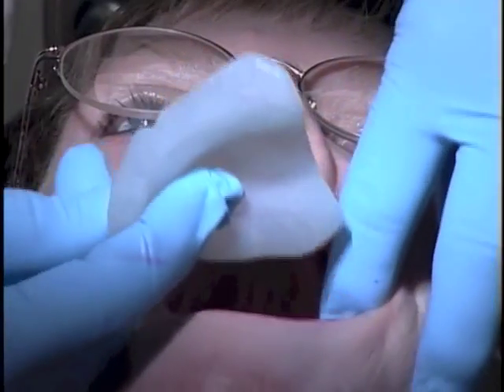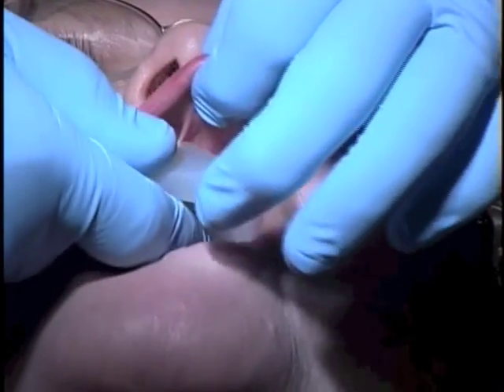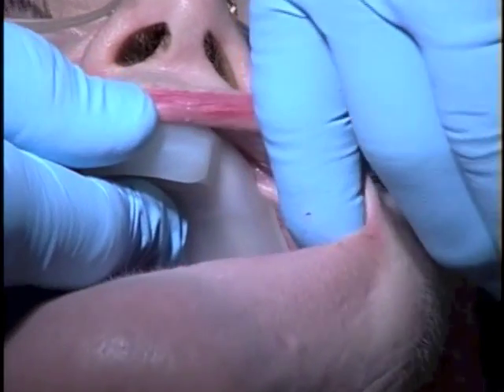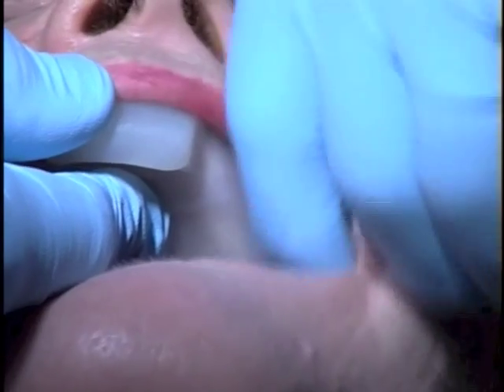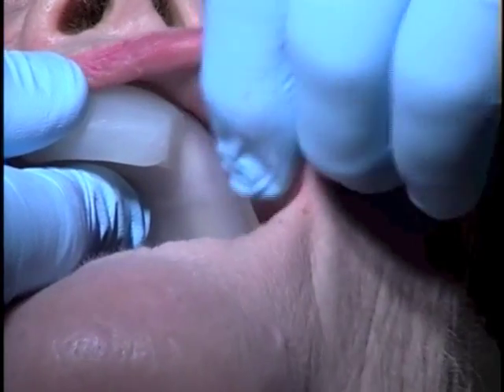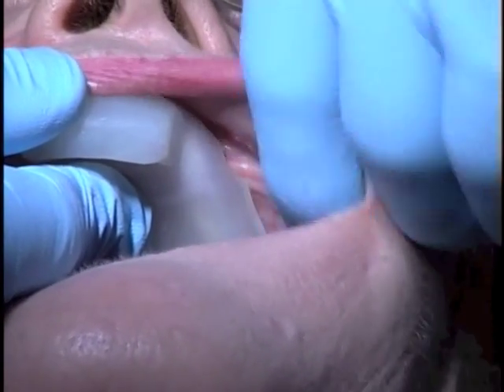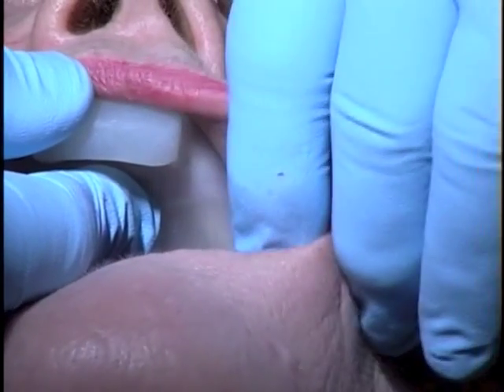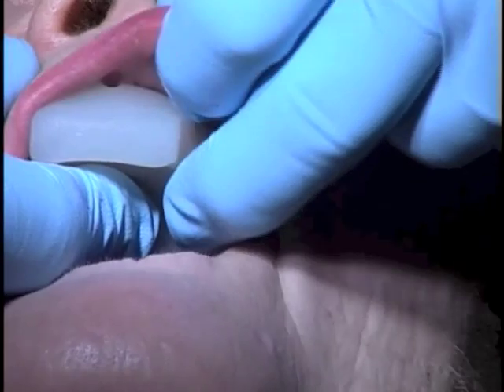We're now going to try the maxillary tray into the mouth, seat it all the way, and judge the length of the periphery. And we see that it's a little long in the zygomatic process area and just relax your cheek, there we go, and just distal to the buccal frenum. So we will want to reduce the tray somewhat in that area.